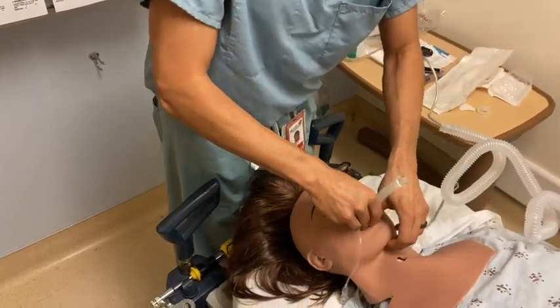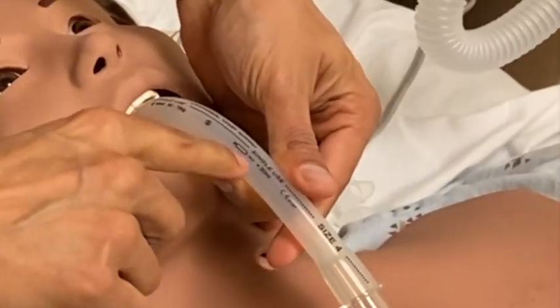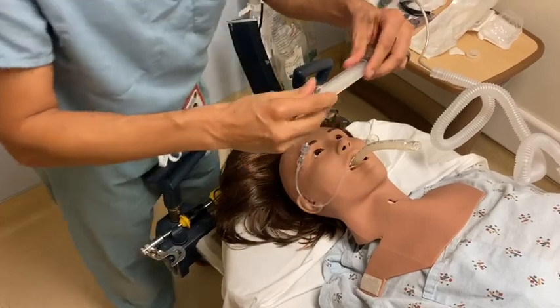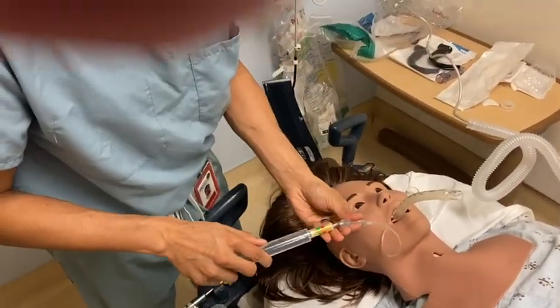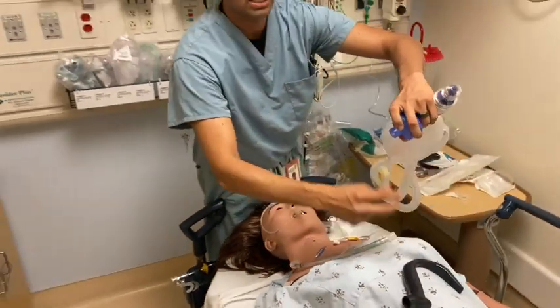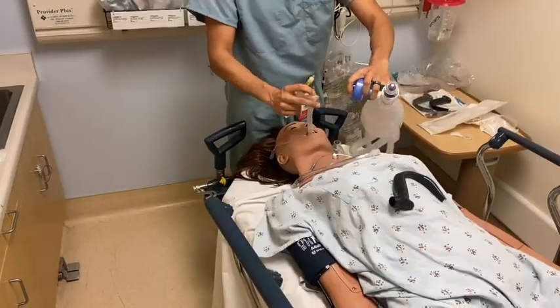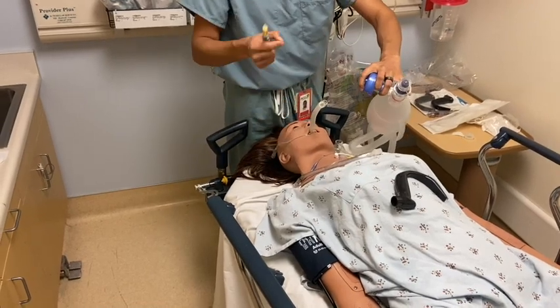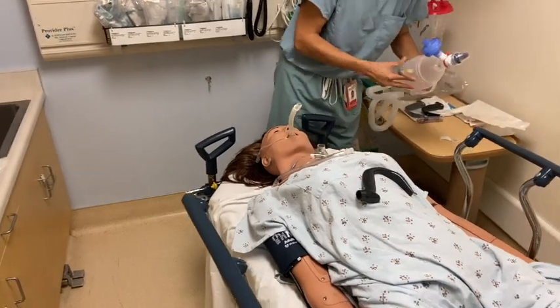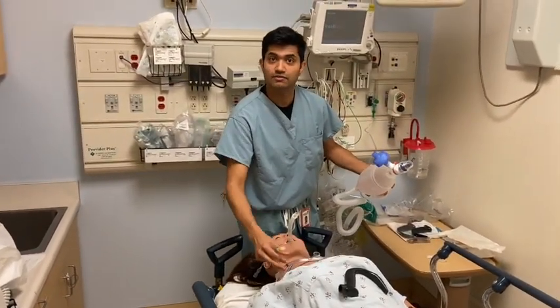Once you're down in the hypopharynx, you would see on the side over here in the adult how much air you can insufflate. Here it says air 30. So you'd take the syringe, pull up, and then insufflate the airway. At this point, remember, do the same thing, keeping the biofilter on, attach to the airway, and then go ahead and bag the patient. Tube through, and either you can just run the tube or a bougie and line it over, or you could just remove this after deflating the balloon and then try again using video laryngoscopy.